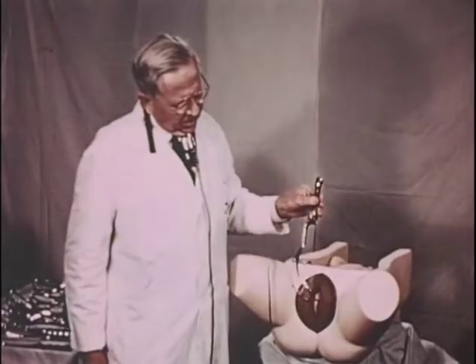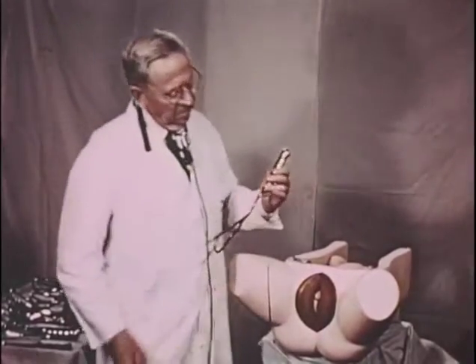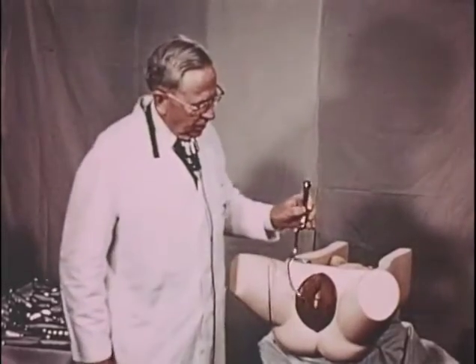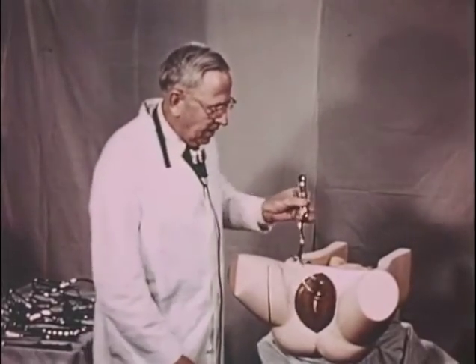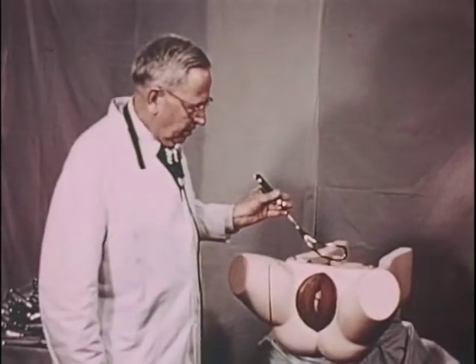The instrument is held in the left hand by the pencil grip in a manner in which the fingers can be used to carry out rotation of the blade as it follows the cephalopelvic curve during introduction.